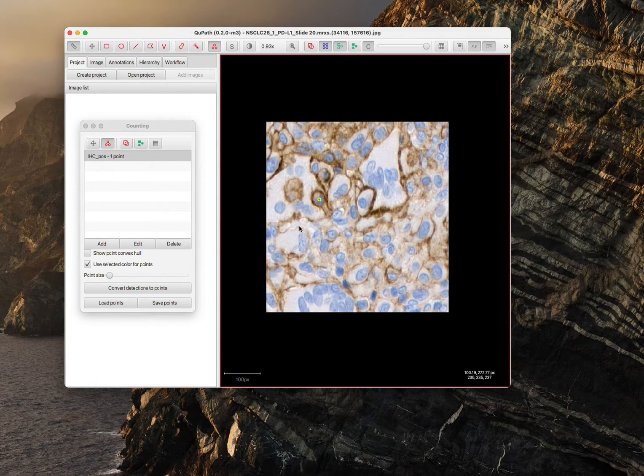I think this is one, and this is potentially another one, another one, another one, another one, another one. So another one, I think it's another one. Once you make those annotations, if you wish to change them, you need to click and hold, and then you can move it around. If you release your mouse, this annotation will be dropped to its correct location.